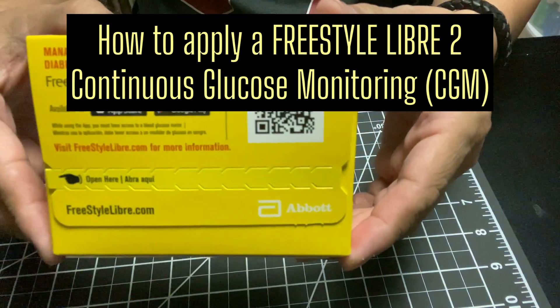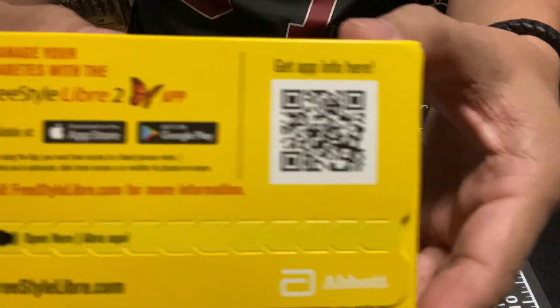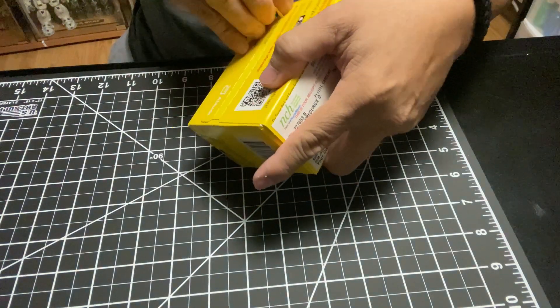This video will show you how to apply a continuous glucose monitoring system. I have here a Freestyle Libre II manufactured by Abbott.